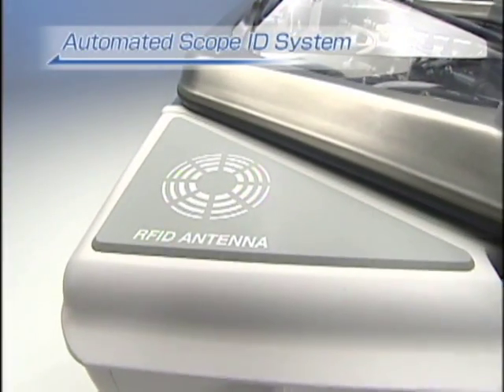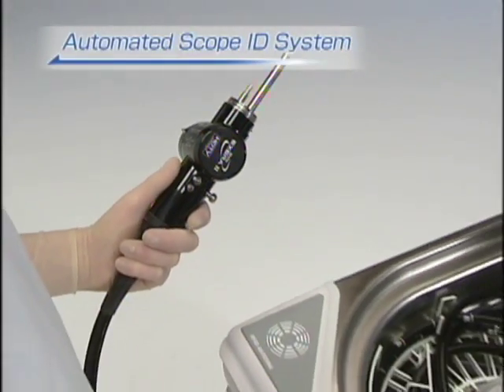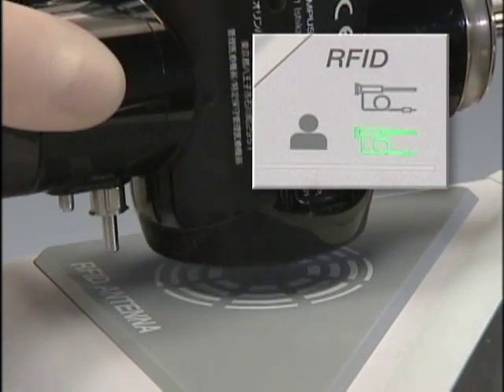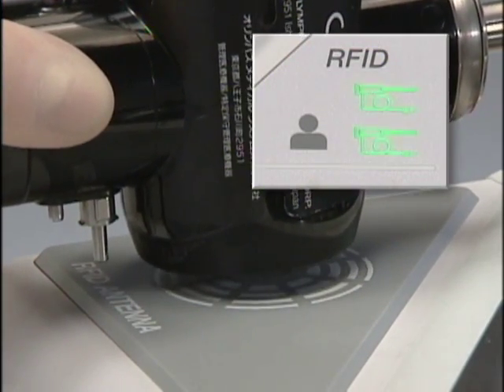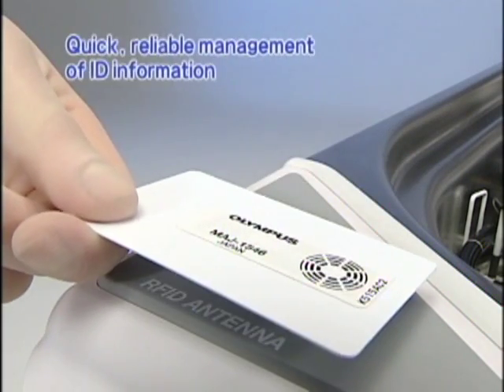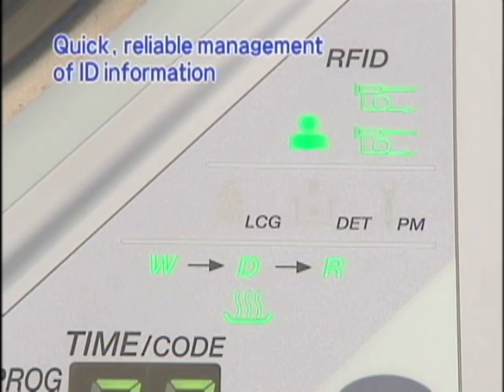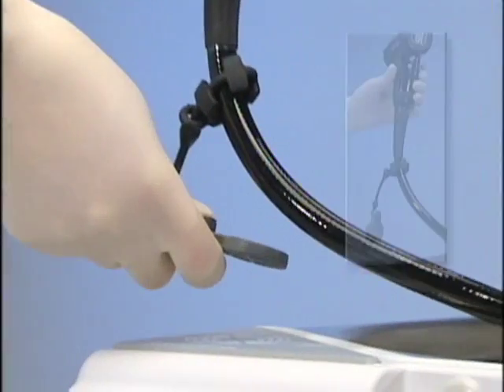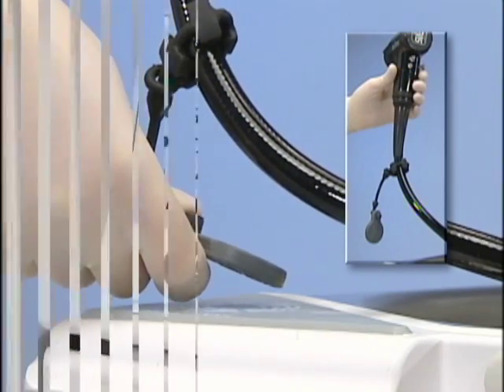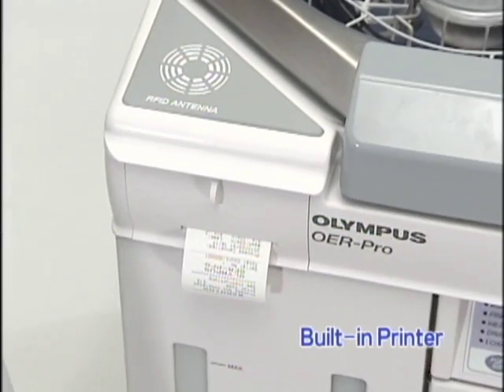The OER Pro features an automated scope ID system. If you're using an Olympus Exera 2 180 scope with a built-in scope ID chip, all you have to do is bring the scope near the OER Pro. It can read the scope information, enabling you to quickly and reliably manage the ID information. Of course, we can provide an external ID tag for older model scopes, and the built-in printer can print out scope usage history.